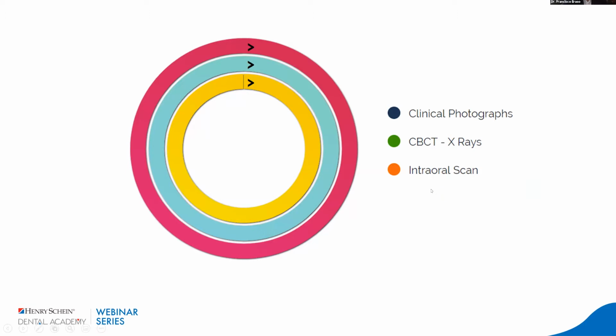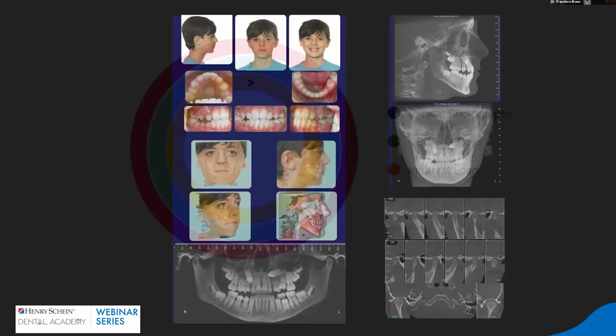And of course, I use intraoral scans since 2015 to today. I have an iTero, I have a CBCT, an iCAT. This is my second iCAT. I say this is my second Ferrari that I parked in my office. I don't remember the price, and I'm not going to go into the pricing, but I have that technology in my office all the time, lasers, all of the things. But digital imaging, I'm obsessed with taking good diagnostic information.